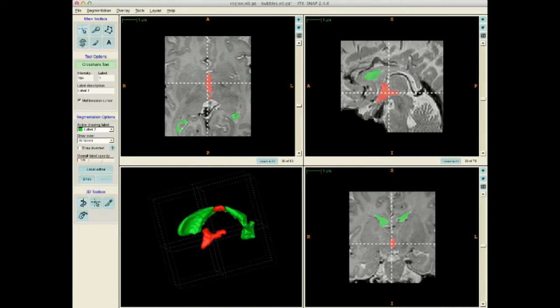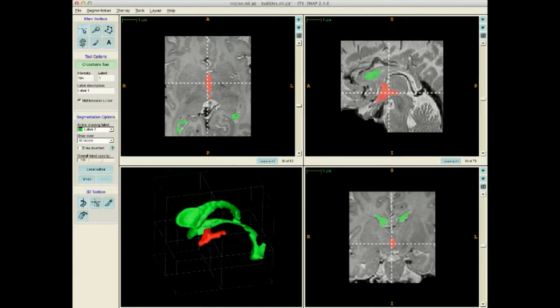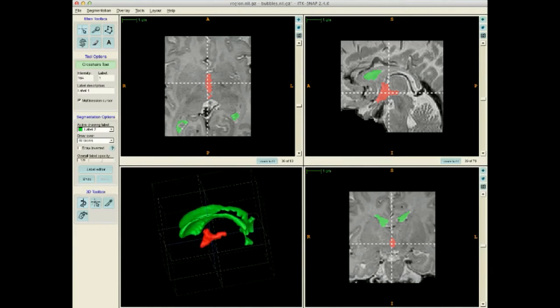Okay, there's a little bit left over here. And you click the 3D scalpel again and select. Oh, that's the wrong direction. Then you just do it the other way. Okay. Then accept. Then update mesh. And when you want to rotate, you have to remember to click the 3D trackball mode. So you can see now you separated the third ventricle in the middle, the small one, from the lateral ventricles.